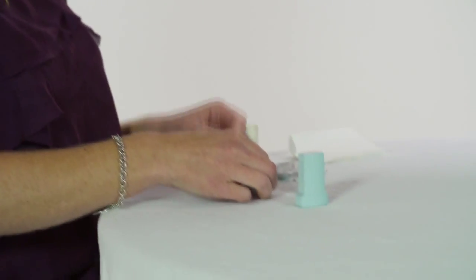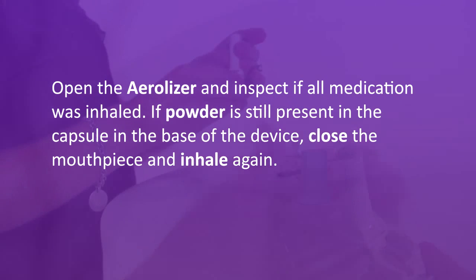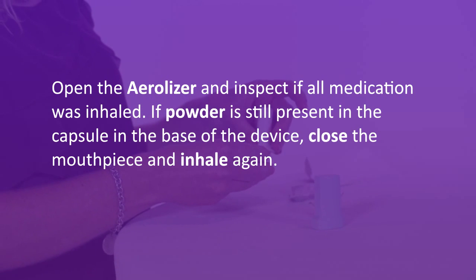Open the Airelyzer and inspect if all the medicine was inhaled. If the powder is still present in the capsule, in the base of the device, close the inhaler and inhale again.